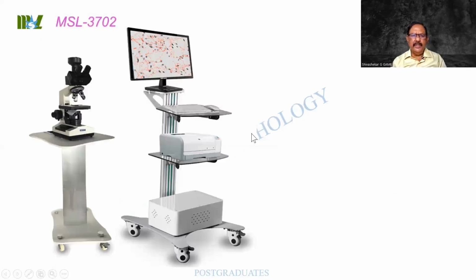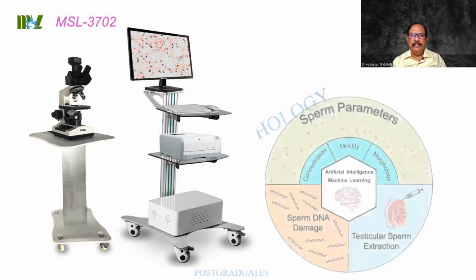This is something that is happening in automation. Earlier we used to look at it under the microscope and then take a picture of it. Now there can be an attached one with this. So you find that there is a machine just like your cell count, a Sysmex or so, and there can be a picture over there, and the count is being recorded on the computer.